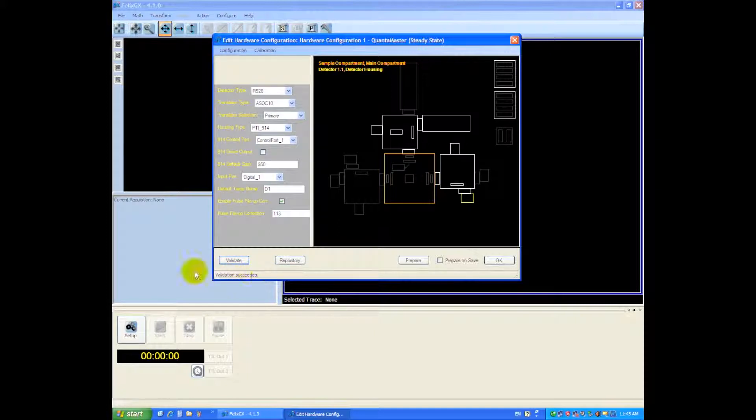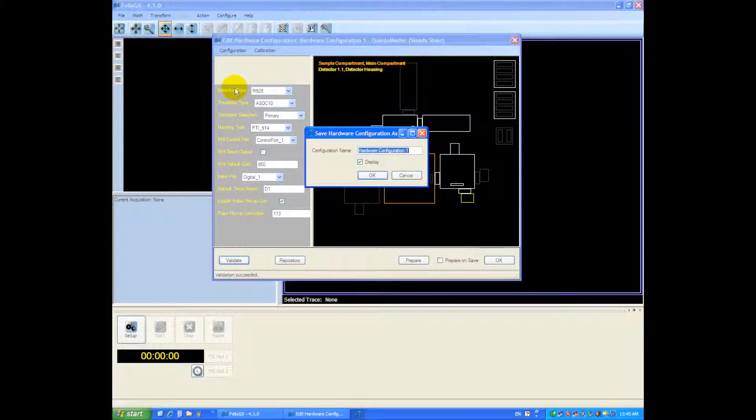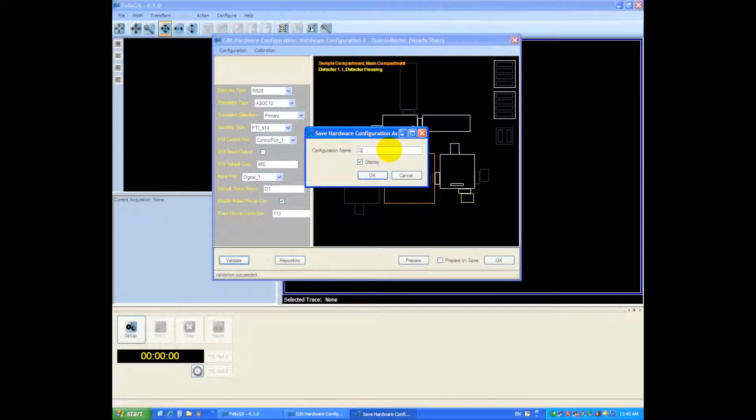So this one has validated successfully and then what we're going to do next is save this configuration. I'm going to call it save as and this system is a QM40 so I'm going to call it QM40.